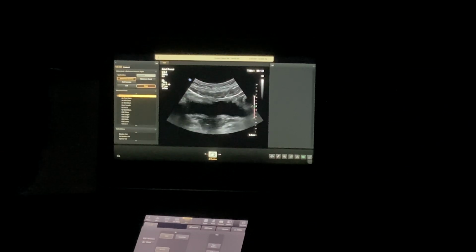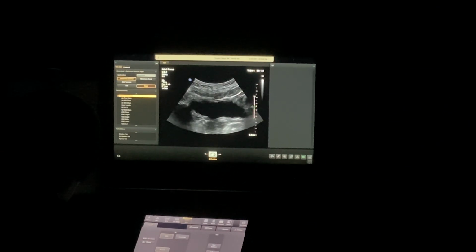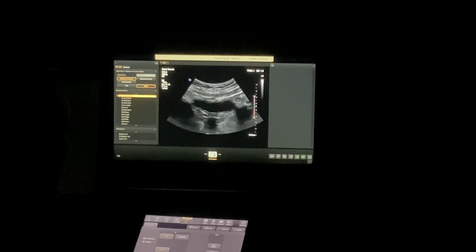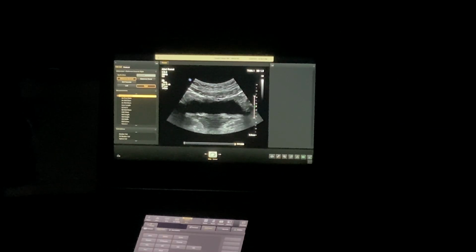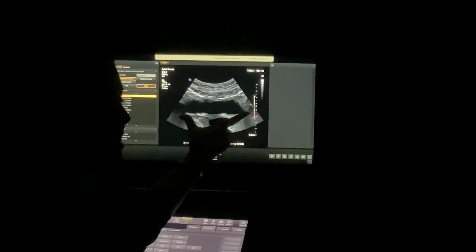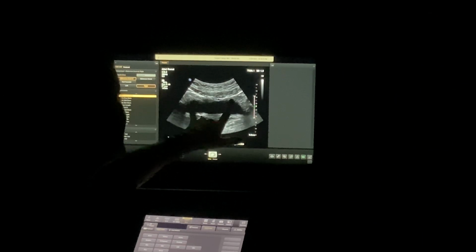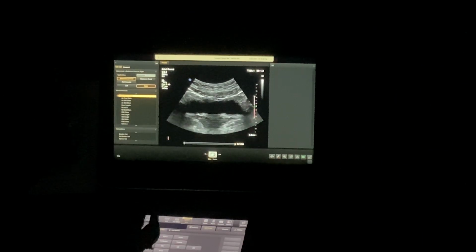So when you do the bladder, I think we just have you do one in each plane at the largest part. Long and trans, that's all you gotta do. One long, one trans at the largest part. So as I'm scanning all the way through the organ, is that the largest? No. How about there? More so. What about that one? That one's probably the largest, right? And when I say largest, I mean widest, because we're in transverse, right? So that's going to be a width measurement when we do a volume if you want your extra credit. That's what we mean when we say the largest part of it. Show me where you think it shows the most volume. So that would be your trans.